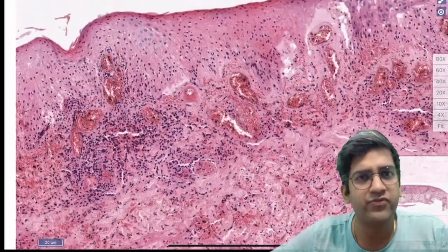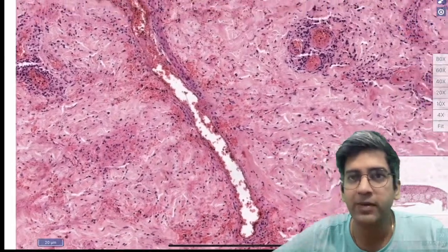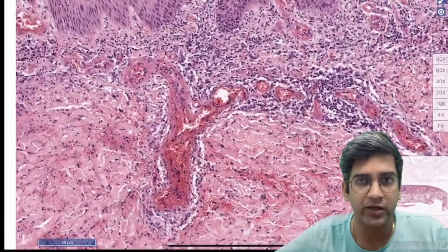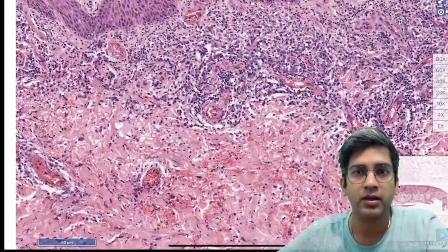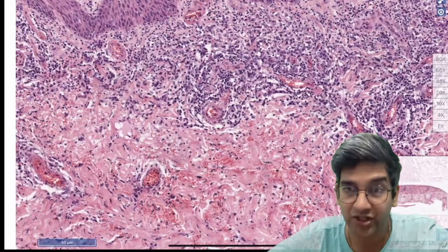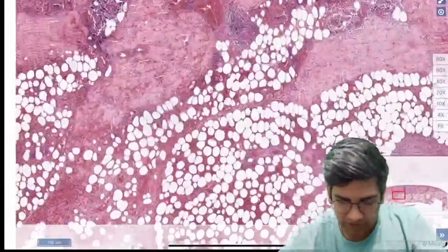Just tell me whether you feel it is normal, abnormal. That's enough for me. Yes, no, maybe should be more than enough. Do you think the dermis is normal? I'll zoom out a little bit if you require it. I'll zoom a little bit as well if you require it. Okay, I got 2 people to call dermis abnormal. That is Sri Shraddha, Hakim as well as Junu say it is abnormal. Okay, great, perfect. Okay, let's go to the subcutis.